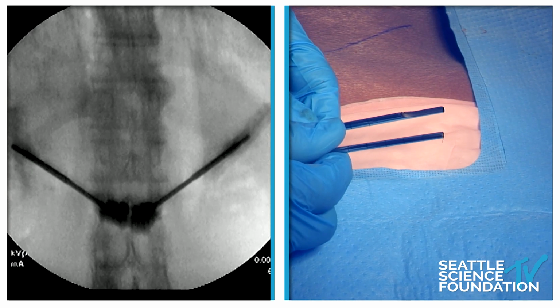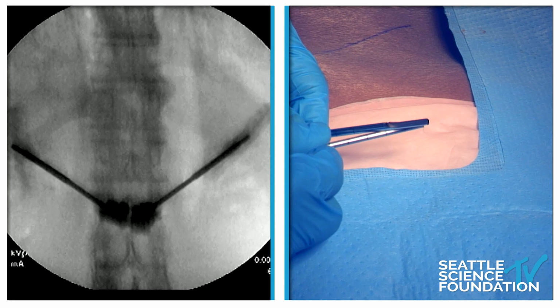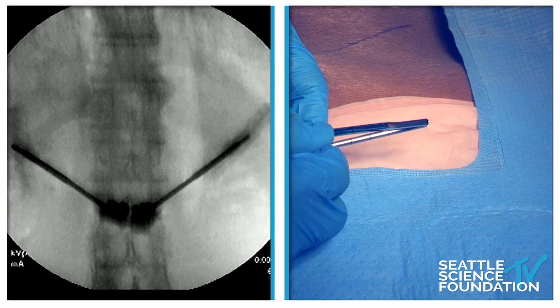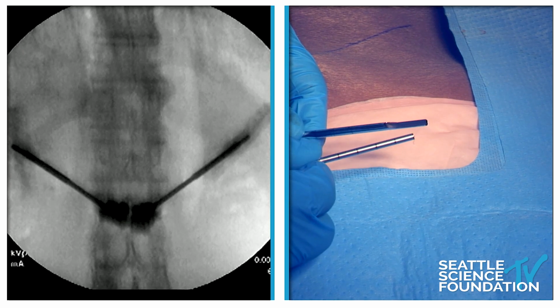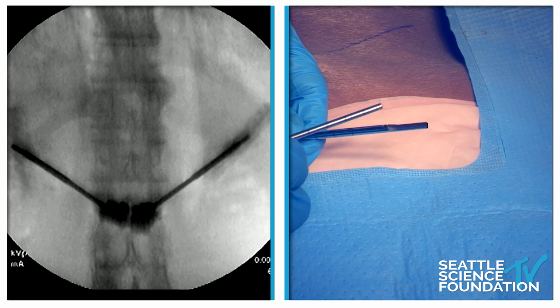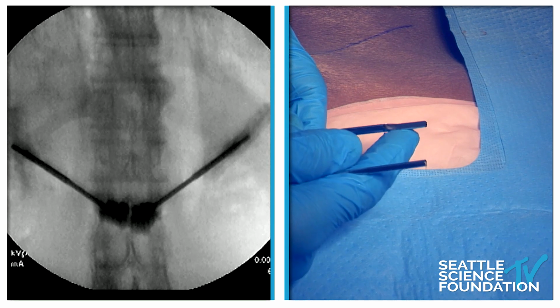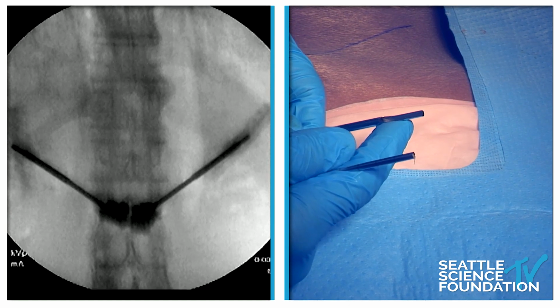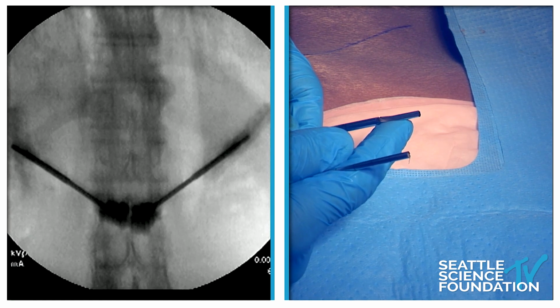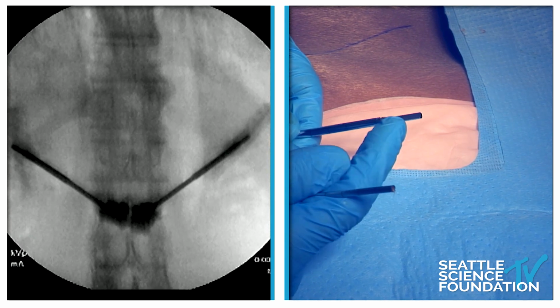What this is designed to do is this bottom part is designed to fit toward the inferior portion of the vertebral body typically, and the balloon expands right here by virtue of the backstop. This is the back of this Kyphon Assist cannula. So this is a directional balloon capability. This has the ability to get your balloon to go superior.